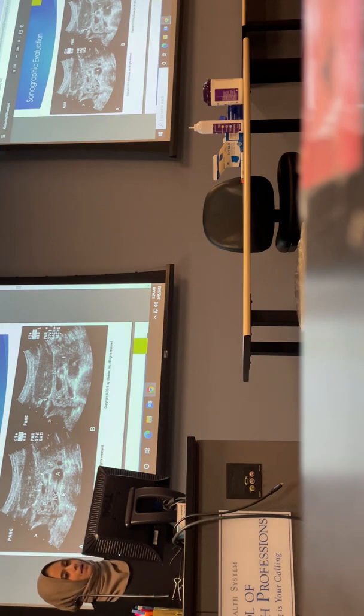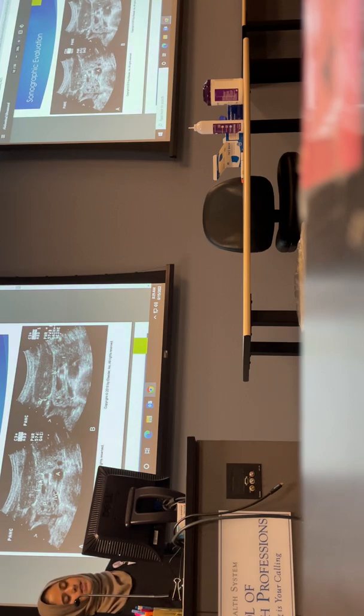So in this image right here, you can see the uncinate process. This is the head, then it goes into the neck, the body, the tail. Everybody okay with that? Now remember your surrounding anatomy. The anechoic circular structure to the left of the patient is the aorta. Anterior to the aorta we have what? SMA. Here is the IVC.